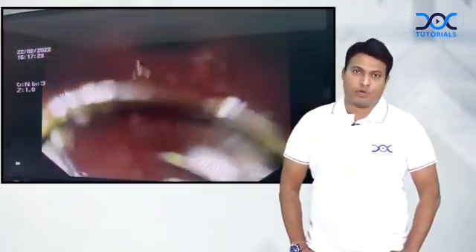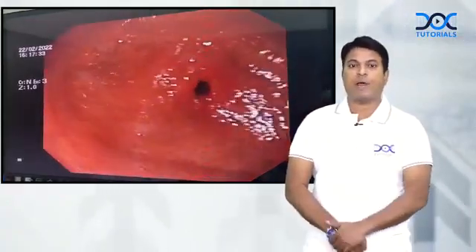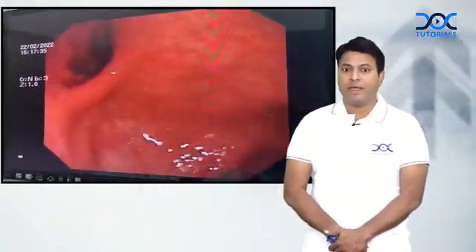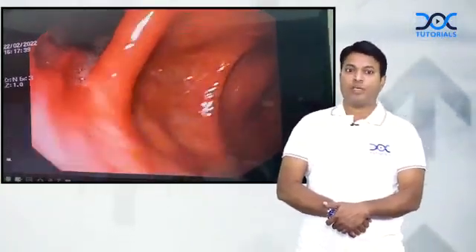You can see there are severe erosions. I am doing a J-maneuver and I am seeing the incisura angularis, going to see the proximal stomach. The fundus is being seen by this J-maneuver.